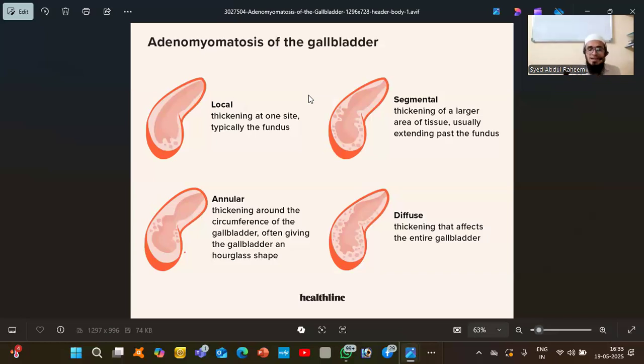So we discussed the important scans. Okay, but in the radiology of the liver, we need to do MRTP. TP is nothing but triphase. I already told you: arterial phase, venous phase, and delayed phase. These are the three combinations we'll get in the scan. Okay. So this is all for today's class.